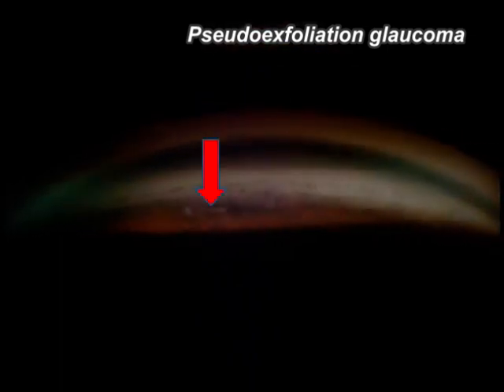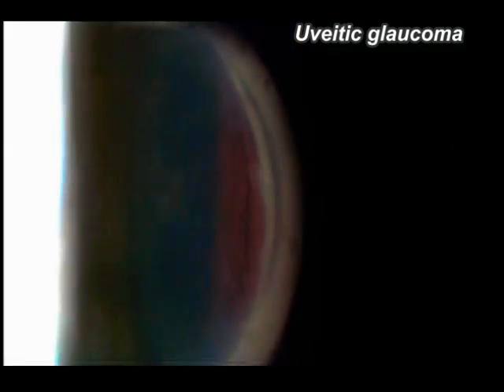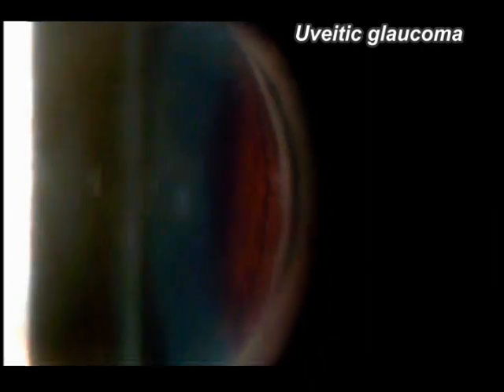Again we can see the pseudoexfoliative fluffy material in the angle. This is the angle in cases of uveitic glaucoma. Now this is the angle seen in cases of angle recession glaucoma — note the widened angle.